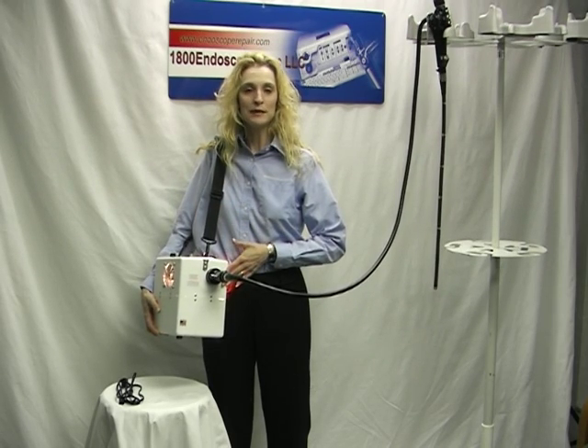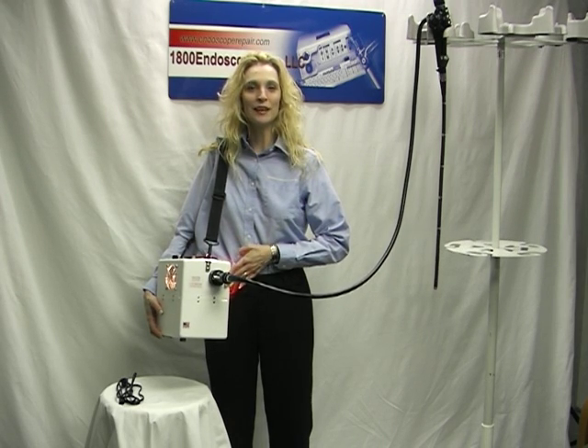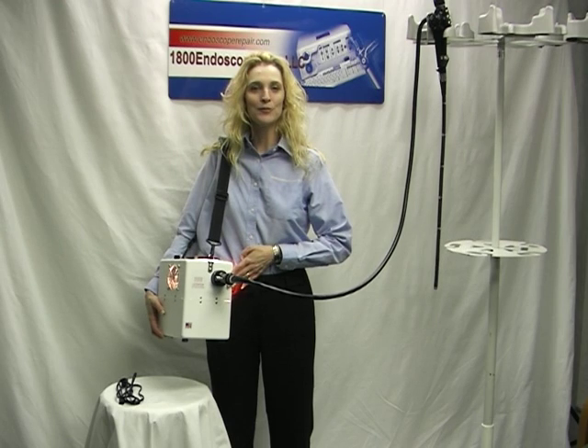The 1-800-LSP Portable Battery Operated Light Source. Thank you for choosing 1-800-Endoscope.com.